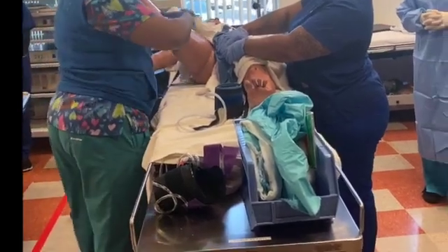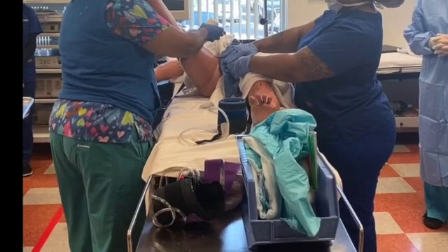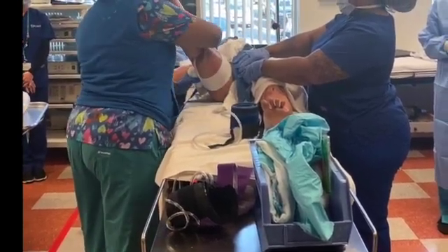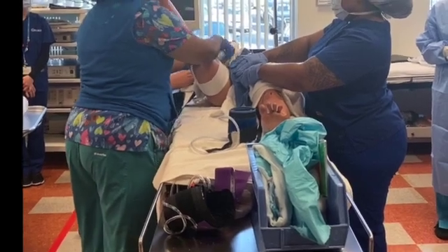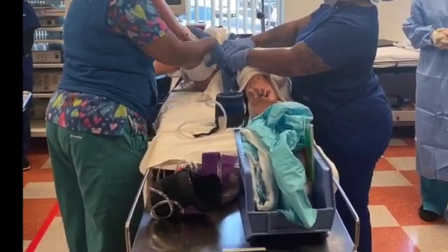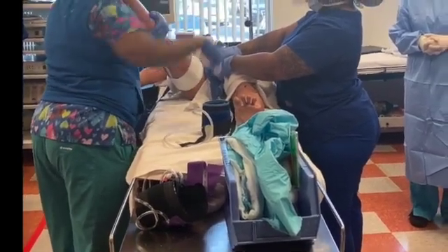A lot of times this leg comes up. We get very comfortable with these patients. How you doing? Good, how are you? I'm good, I'm good. I'm just trying to live my best life. Living my best life. Putting on this tourniquet. Okay. Where am I at, Ed?